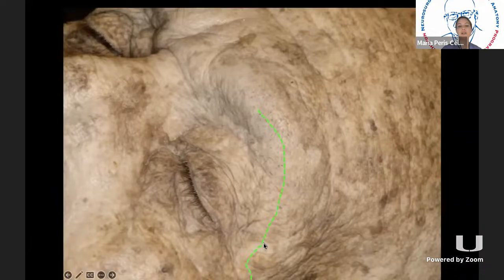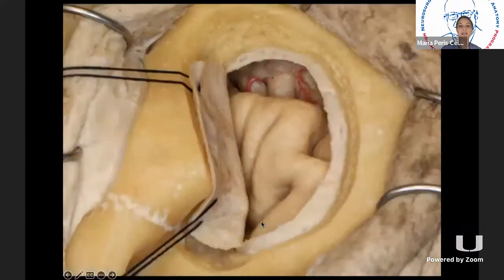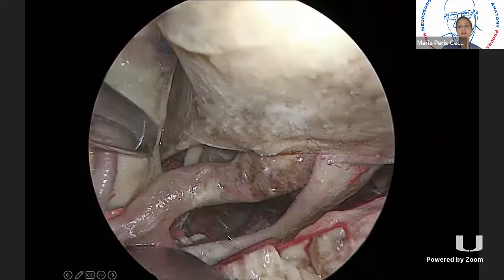Other kinds of incisions that are not technically through the orbit, or just supraorbital, for instance, like an eyebrow, we can also do an eyelid incision, but this is like a supraorbital craniotomy. We want to be medial to the supraorbital nerve. And this is how it looks after we drill the surface. We can retract gently the frontal lobe. And this is really a great view through that approach, assisted with the endoscope, of the optic nerve and the carotid artery. This is the third cranial nerve, and this is the tentorial edge.